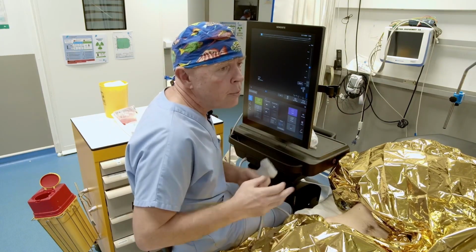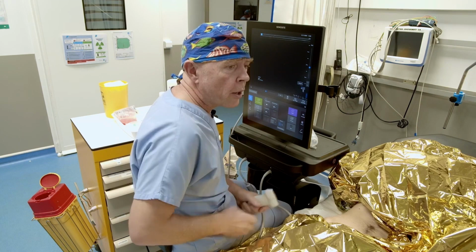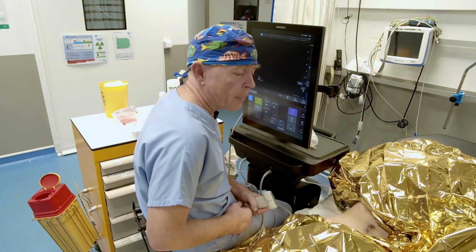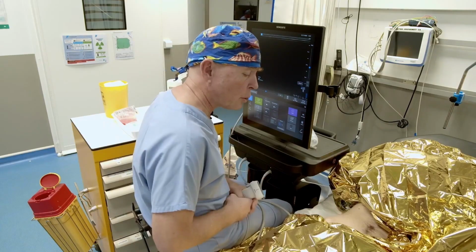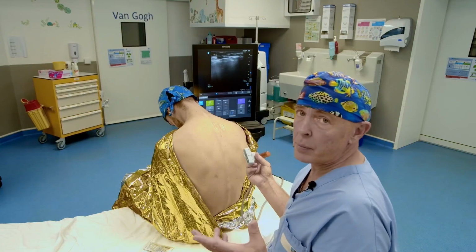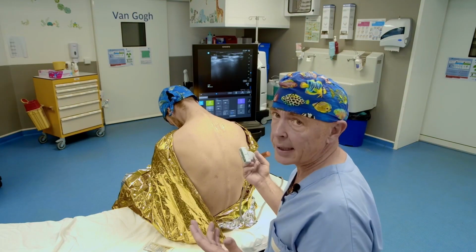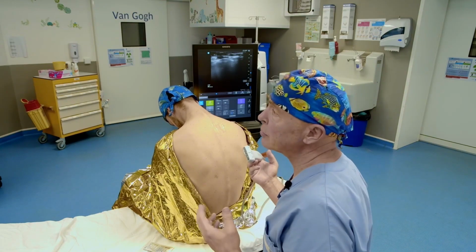Generally, I do them on an awake patient to go faster. And above all, to have a better view of my needle and the area where I'm going to operate. So let's get set up. And then we'll show you this last block. Here it is, the last block in this series from the practical workshop, step number 4, the paravertebral block with its variation, the erector spinae block.